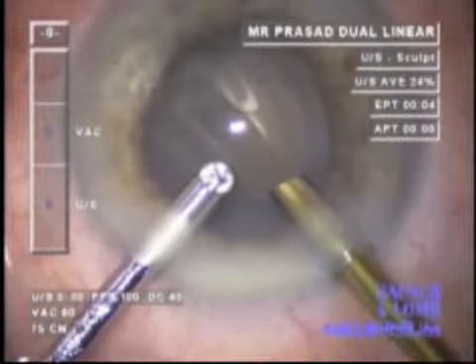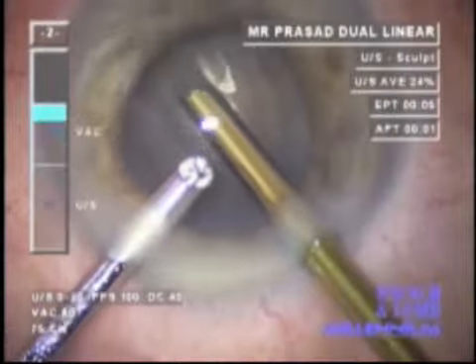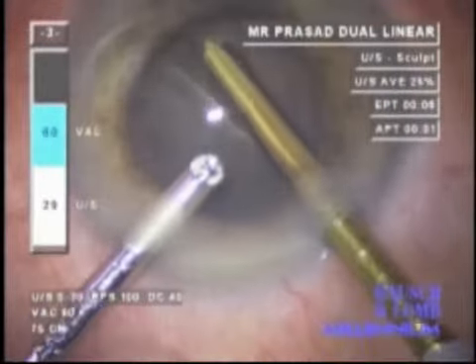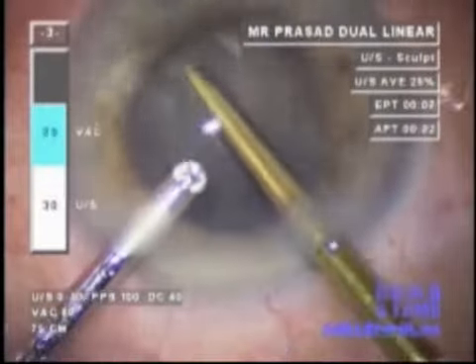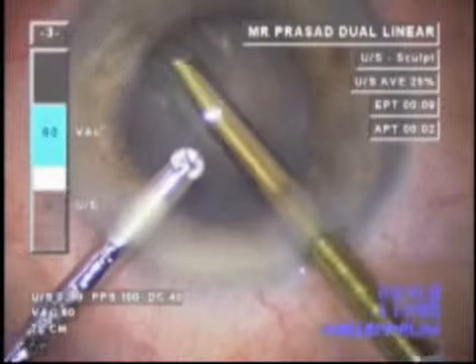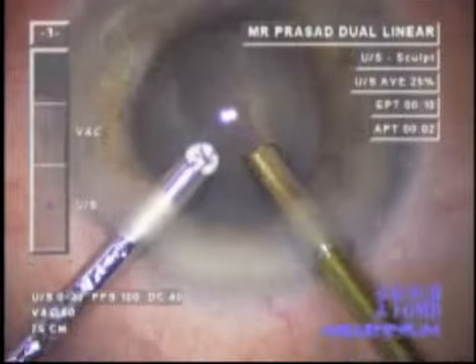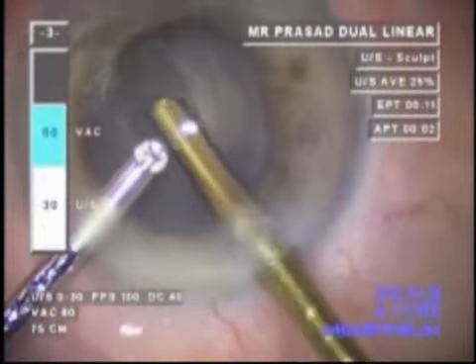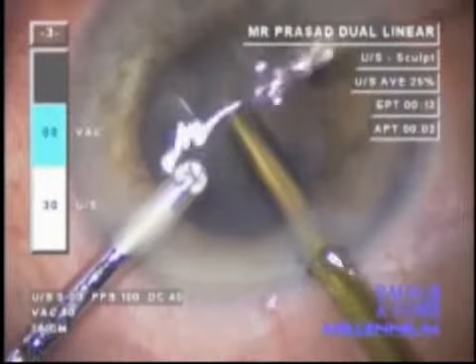Biaxial phacoemulsification is then undertaken and, as you can see, neat grooves are made. The Divide and Conquer technique is employed — in spite of the difficult case — as it seems most efficient. As the first groove is deepened, further deepening can be done in a very controlled manner, with the irrigating chopper merely acting as an anterior chamber maintainer.